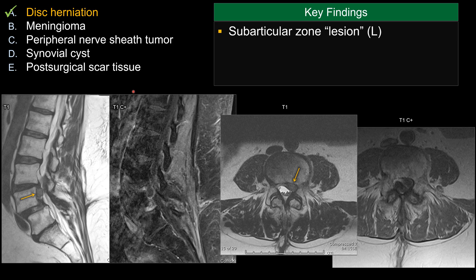A couple of features are important for this case. Notice that there's a mass lesion. On the axial view, you can see the mass lesion is within the left subarticular zone. It is epidural in location. There's epidural fat, expansion of the epidural space, and also causing effacement of the left lateral recess. On the right-hand side, you can see the traversing nerve root.